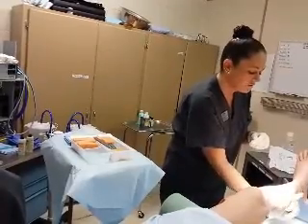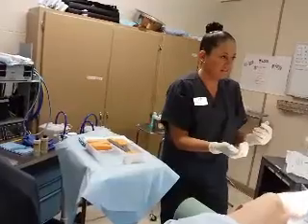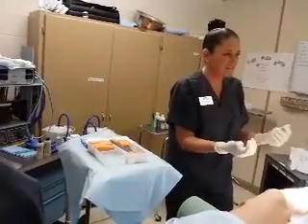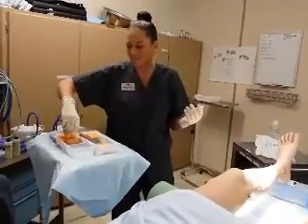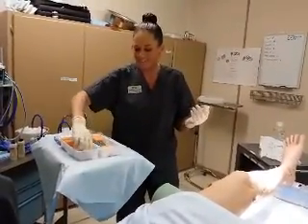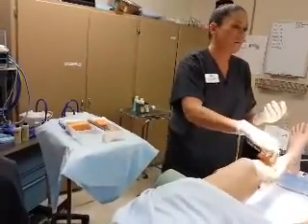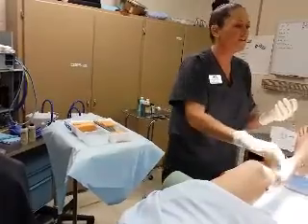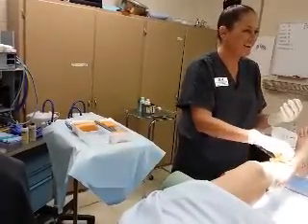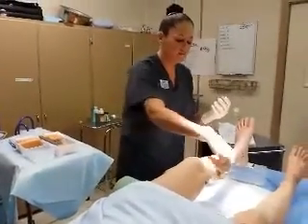We've got to be real careful that the back of your hand does not touch that. This is another trick of keeping sterile, because you have to remember you're sterile, but only to your wrist. Normally when you put on gloves, you think, oh, I've got my gloves on, that means I'm sterile and I can touch my gown and everything else. This is where you've got to really use your noggin.